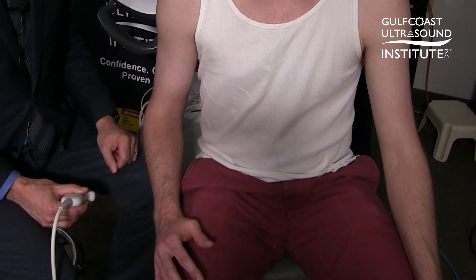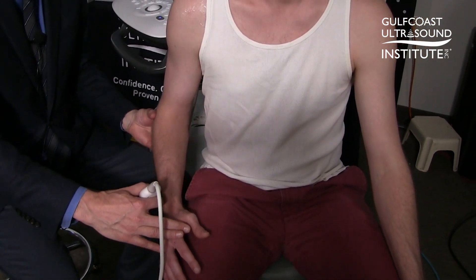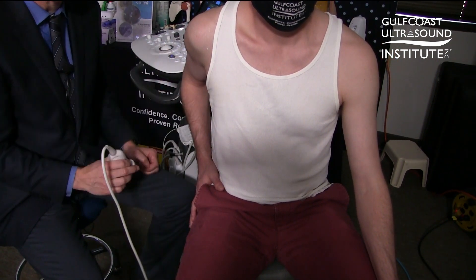To look at the supraspinatus and infraspinatus, I tend to put the patient in what's called the modified crass or Middleton position, with the hand on the hip. Make sure the elbow is pointing back so it's not too much internal rotation.